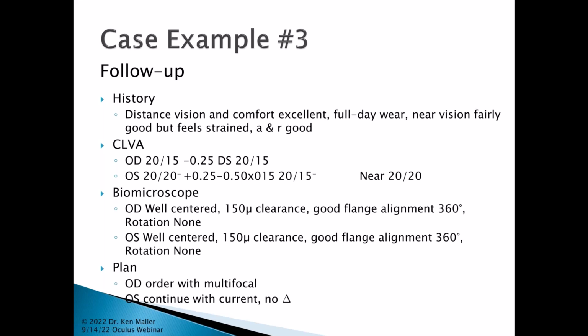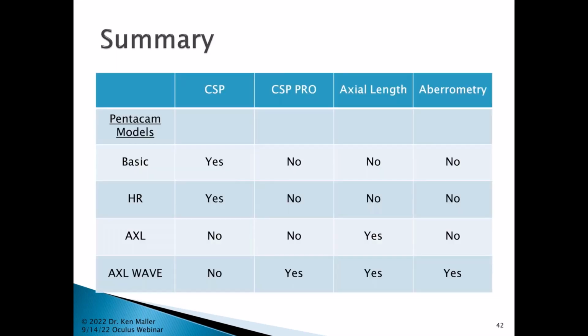No changes at all. I did see her back and she's doing very well with that multifocal on the right eye. So really, in just the course of a couple of lenses, we got her successful, despite the fact that she had had multiple failures over lengthy periods of time with scleral lens attempts in the past.